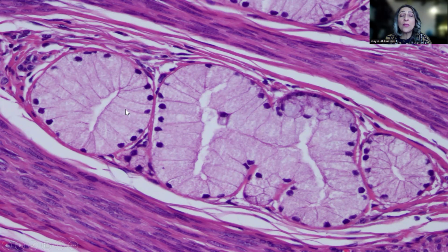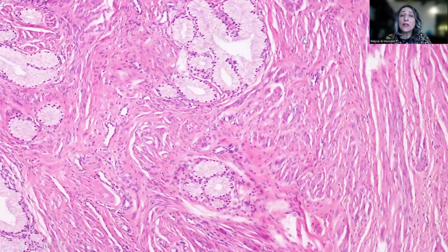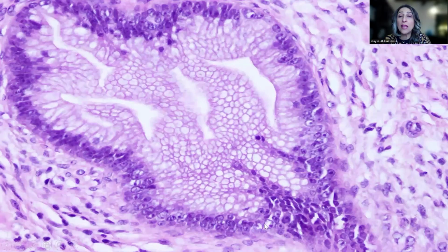Also, please note that there are no mitotic figures, no floating mitoses or basal apoptotic figures, as you would expect with an adenocarcinoma that is HPV associated. Again, these very bland looking glands are going very deep in the stroma of the cervix. Again, just to emphasize that these are not usually associated with desmoplasia.